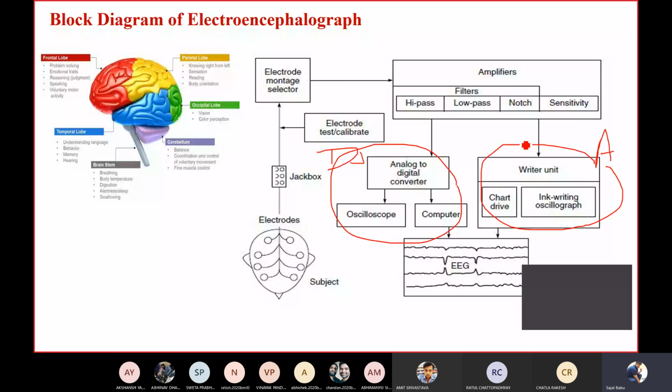Depending upon your EEG signal, the pen is going to move, but the paper is going to move with a constant speed. It is not going to fluctuate anywhere. If you look at any older versions of EEG machine, they use thermal recorders. But if you use a pen type structure here, the frequency of the pen is going to be 90 Hz, and some of the pens are also going to have a frequency response of up to 45 Hz.